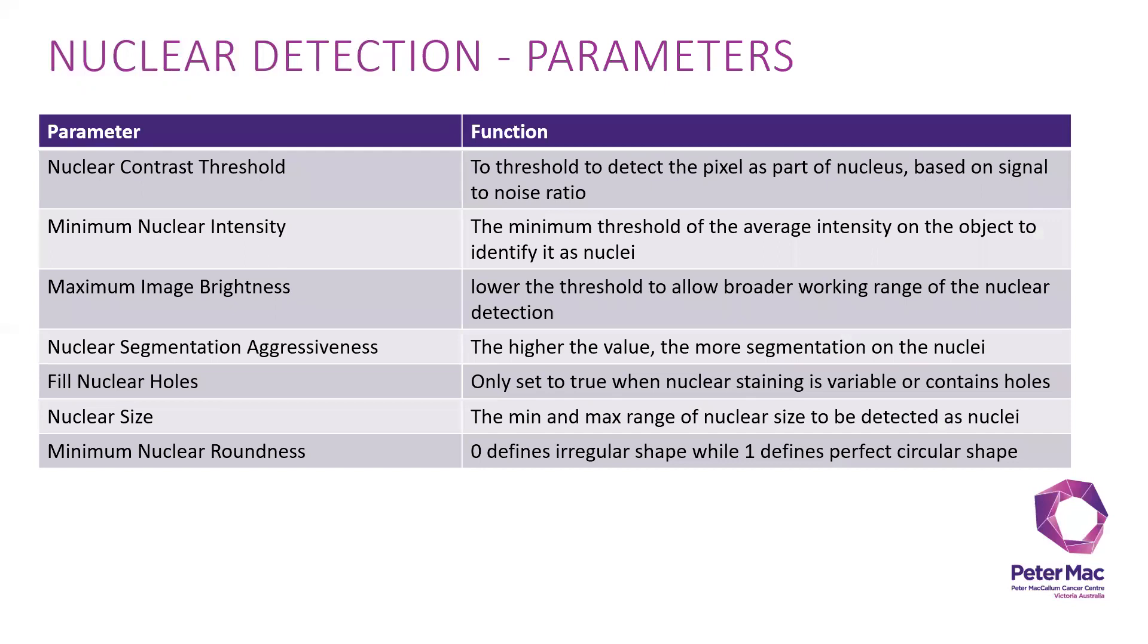It has seven different parameters that you can play with to adjust the accuracy of the nuclear detection. First, the nuclear contrast threshold adjusts to detect the pixel as part of the nucleus based on signal to noise ratio. You adjust the minimum nuclear intensity to threshold the average intensity on the object to identify it as a nuclei.